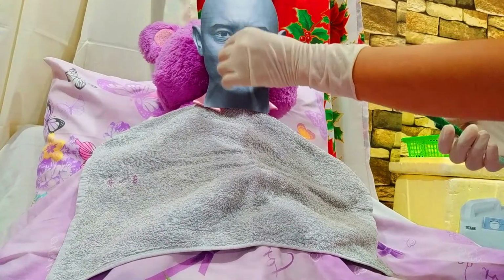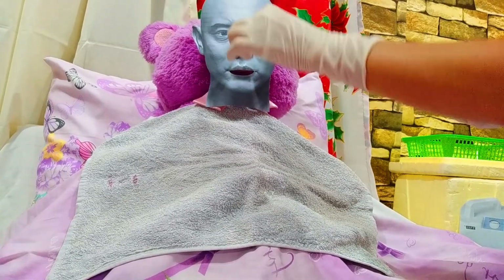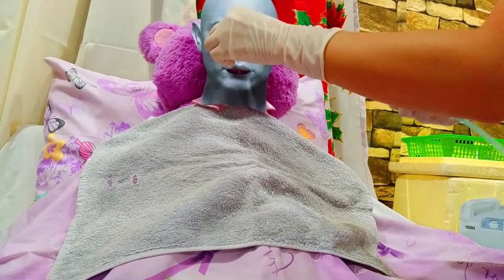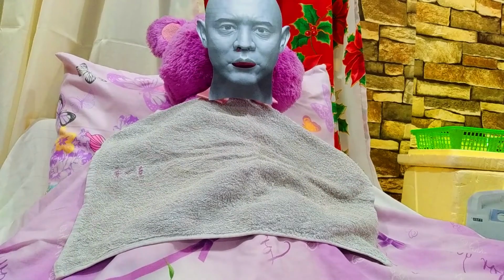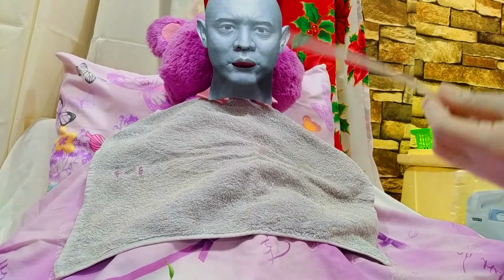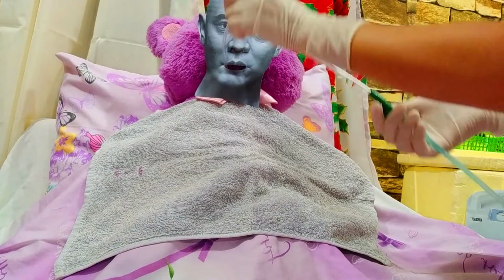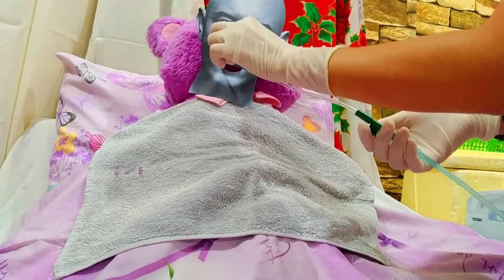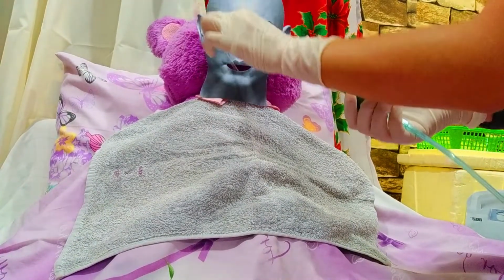Free my fingers to help advance it, and advance the catheter approximately 5 to 6 inches to reach the pharynx. And for the oropharyngeal suctioning, we need to insert the catheter through the mouth along the side of the mouth toward the trachea, and advance the catheter 3 to 4 inches to reach the pharynx.